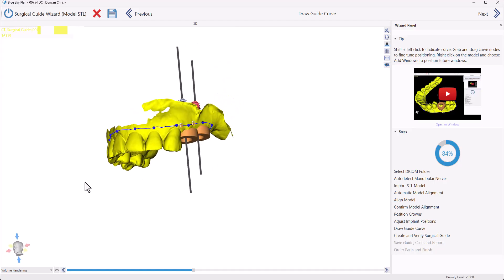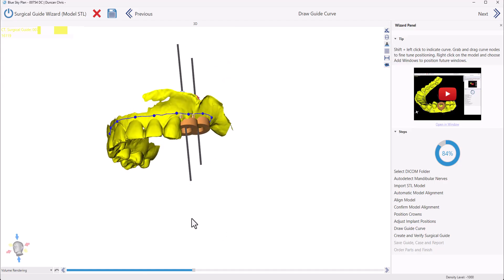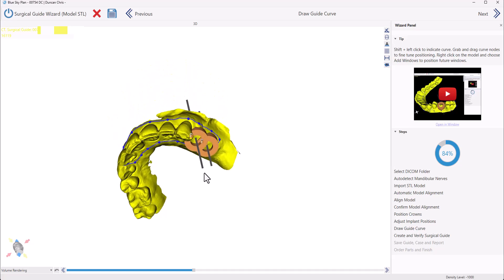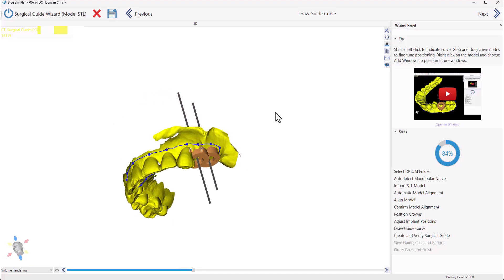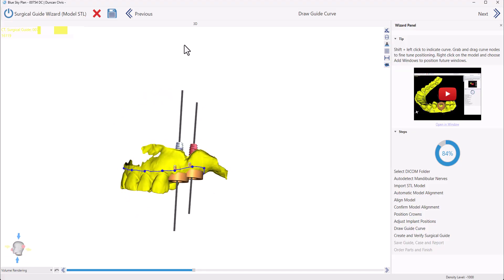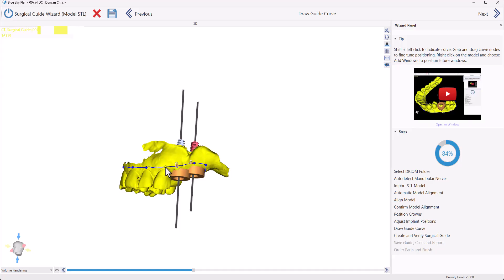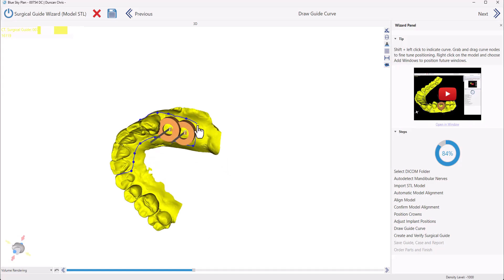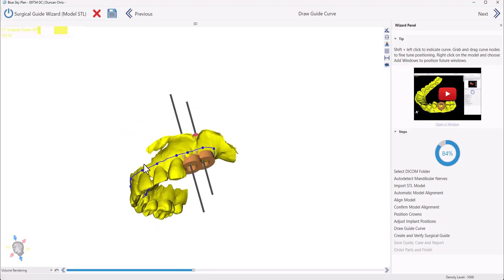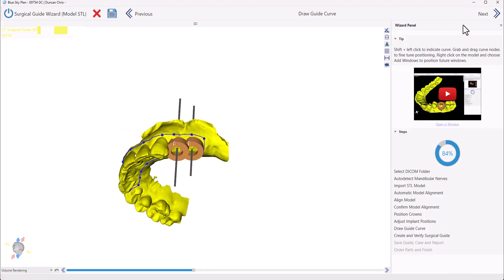We could see now that the surgical guide curve has been automatically drawn for us. Once again, we're going to confirm and tweak as necessary. If we see that the implant positioning needs to be updated, we could simply click the Previous button to return to the previous step and make any updates. Make sure the surgical guide curve goes completely around the relevant areas and has no sharp points. Once you've confirmed that, simply click the Next button.